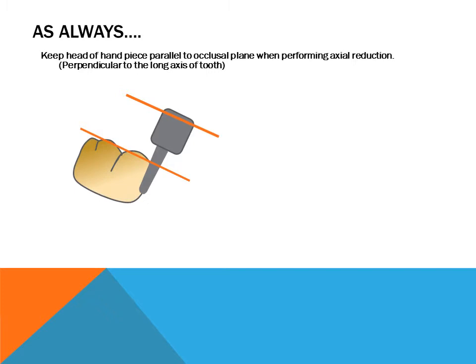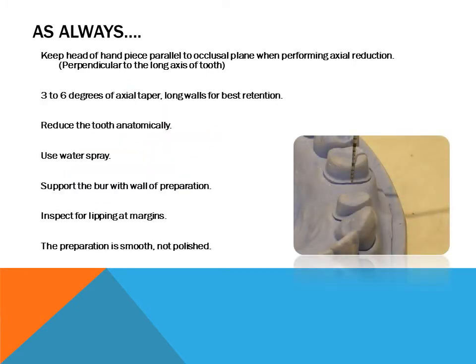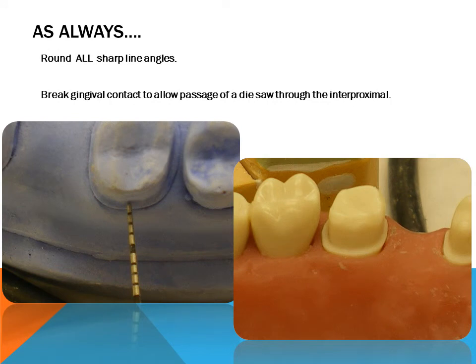Key preparation tips: Keep the head of the handpiece parallel to the occlusal plane when performing axial reduction. Maintain 3 to 6 degrees of axial taper with long walls for best retention. Reduce the tooth anatomically and use water spray. Support the bur with the wall of the preparation. Inspect for lipping at margins. The preparation should be smooth, not polished. Round all sharp line angles. Break gingival contact to allow passage of a die saw through the interproximal.